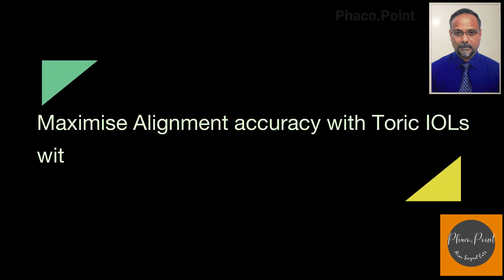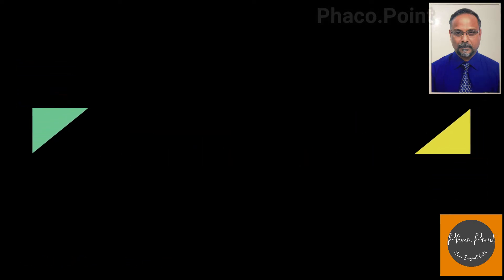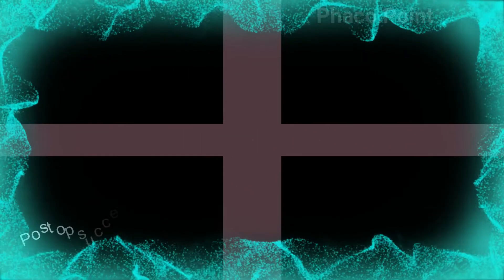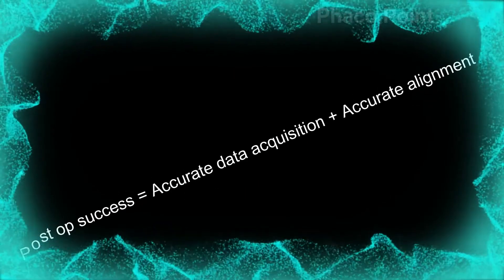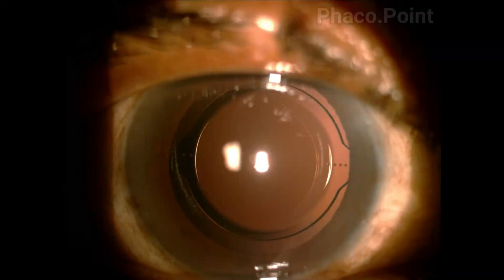I'd like to describe a technique for marking the cornea for placing toric IOLs, which I have been using for the last five years and which has given me wonderful postoperative results. These results of course depend on accurate data acquisition along with a precise and perfect alignment of the toric intraocular lens.